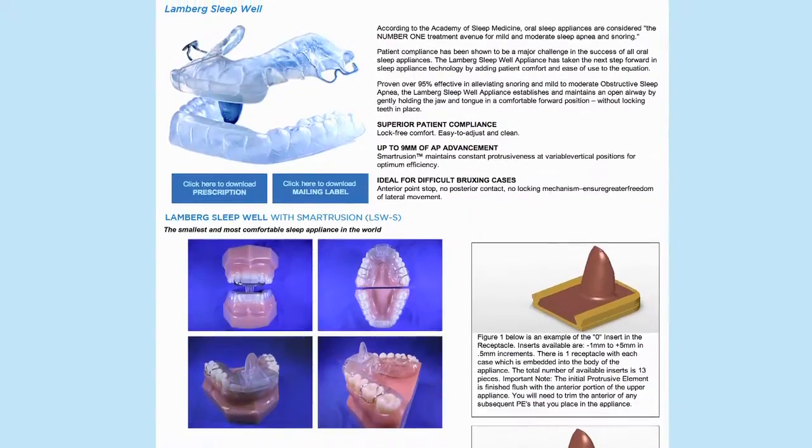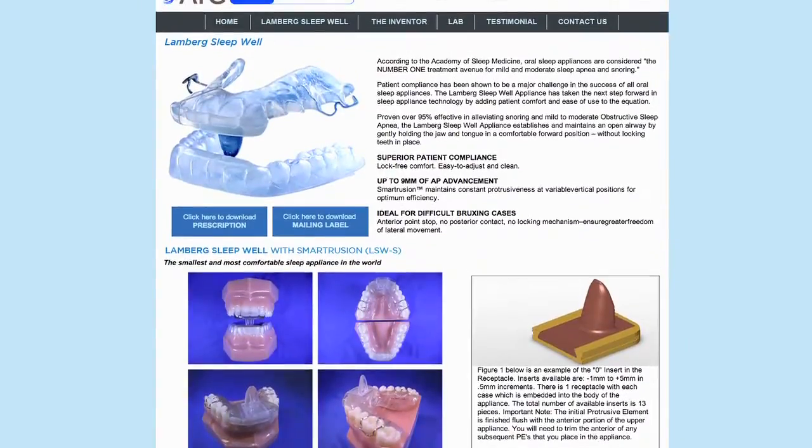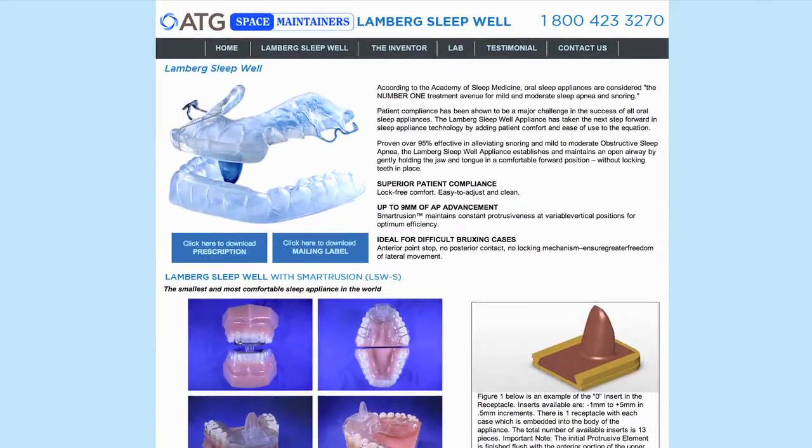I am the developer of the Sleepwell appliance, which is made exclusively at the Appliance Therapy Group, also known as Space Maintainers. The purpose of this video is to show you, the dentist, how to make a bite record so the laboratory can fabricate your patient's sleep appliance in a comfortable and efficacious treatment position.